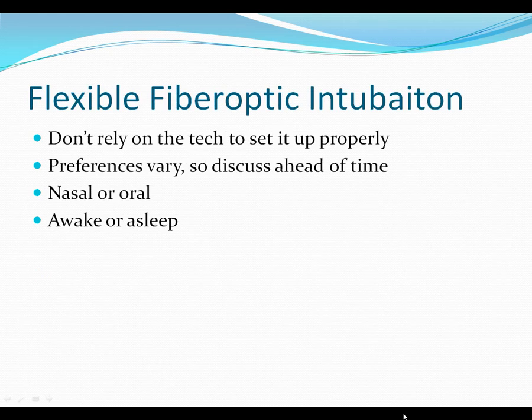Flexible fiber optic intubation. I decided not to talk too much about this. Have you guys gone to the Sim Center for airway stuff yet? Some people, not everyone. It's an excellent course, and they'll talk about a lot of the details about flexible fiber optic intubation. My only advice is don't rely on anyone to set up all of your airway equipment at all. So check the laryngoscope yourself, make sure the light works. But in the same sense, make sure that you know how to set up a fiber optic scope and make sure it's set up properly before you bring the patient back.